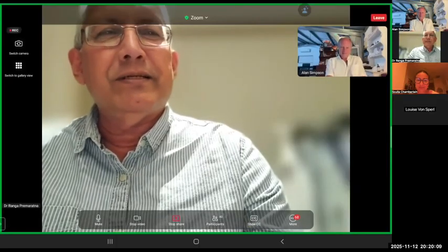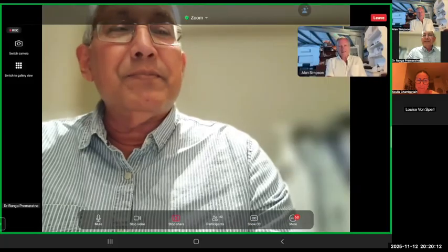When I do the test on the spearmint, I'll let you know. Oh, definitely. Yep, I'd love to know.